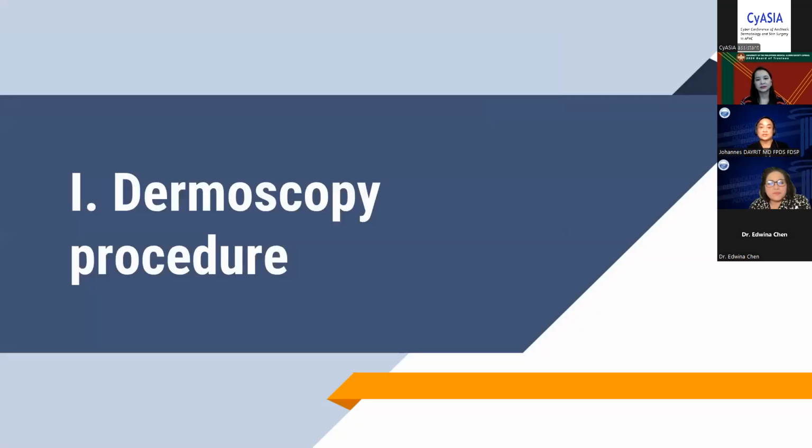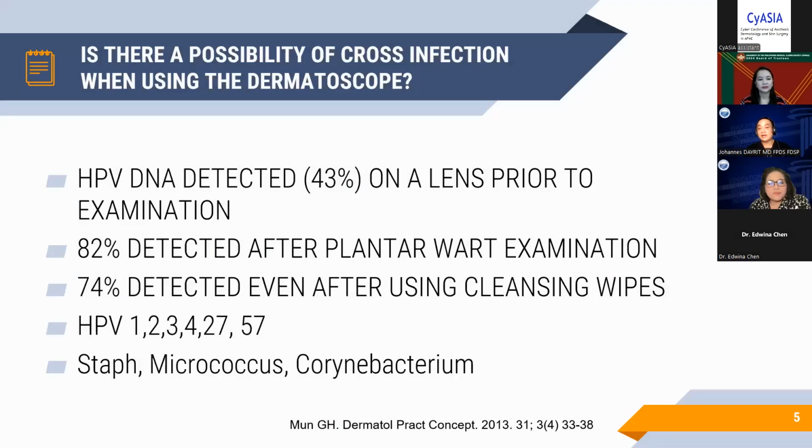So for the dermoscopy procedure, hygiene is, I think, a primary concern. Some articles have already been published answering the question: is there a possibility of cross-infections when using the dermatoscope?